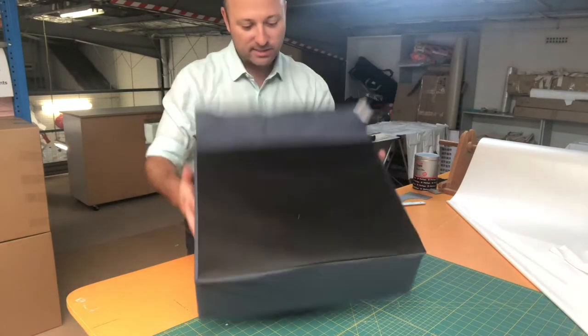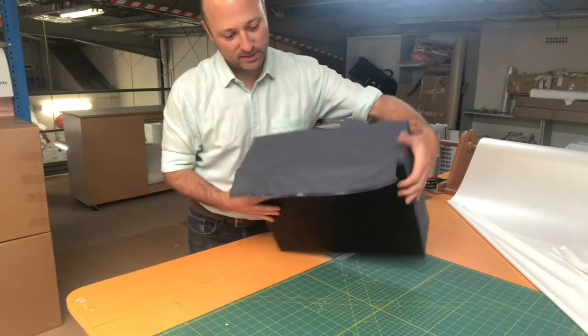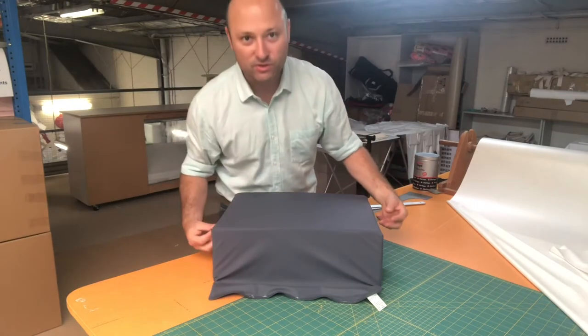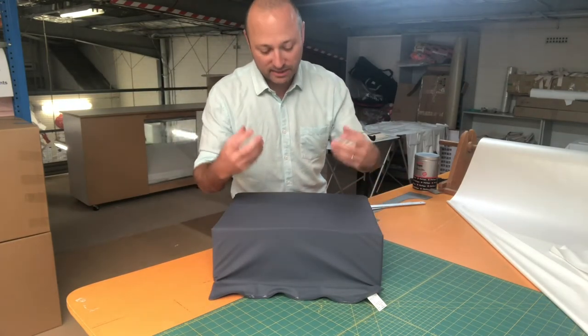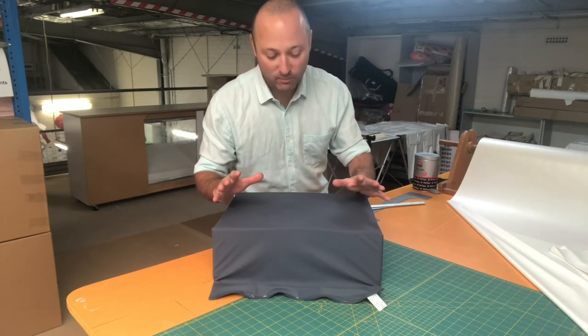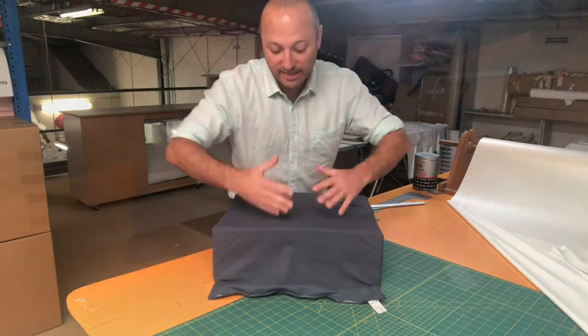This is a basic block we've made up recently, and you can see we've made this flap here. The idea of having the flap is that there's air inside the foam, so as the person sits on the cushion the air has to move somewhere. By having the flap on there, it allows the air to move into that area.